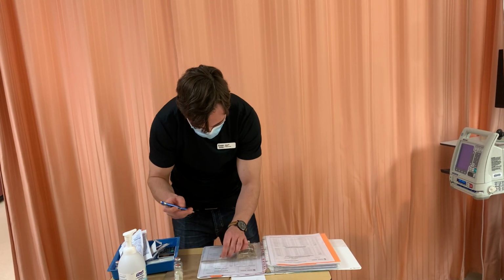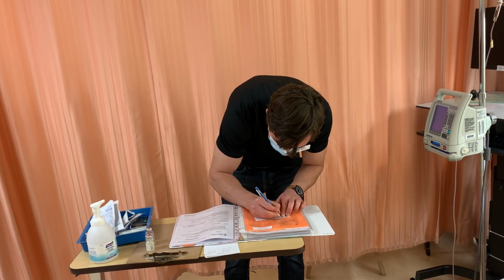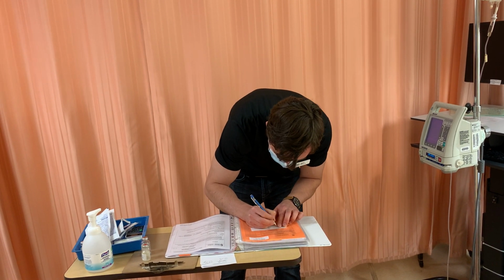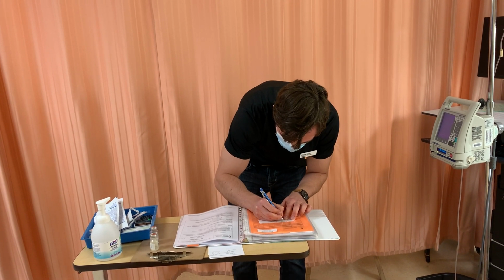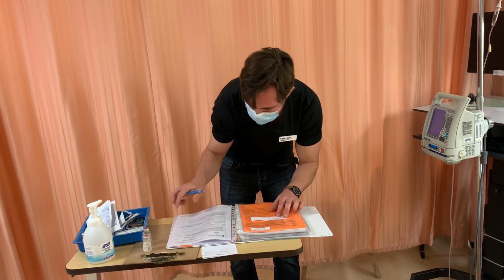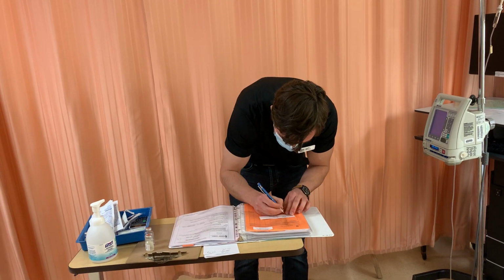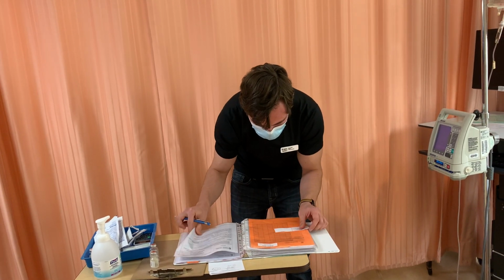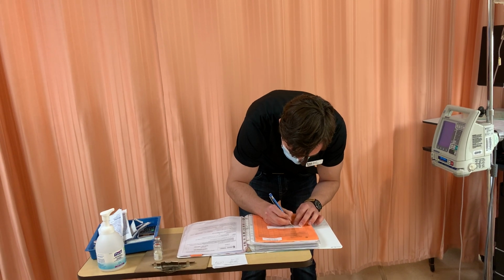Then I'm going to write up a label here. So we have Vancomycin, drug name is Vancomycin, dose is 500 milligrams, volume is 10 ml, diluent is 100 ml, concentration right now is 50 milligrams per ml. So I'll have a total volume of 110 ml. Date and time. The right route is IV. That makes sense because IV medication has been given, so the right time is now.